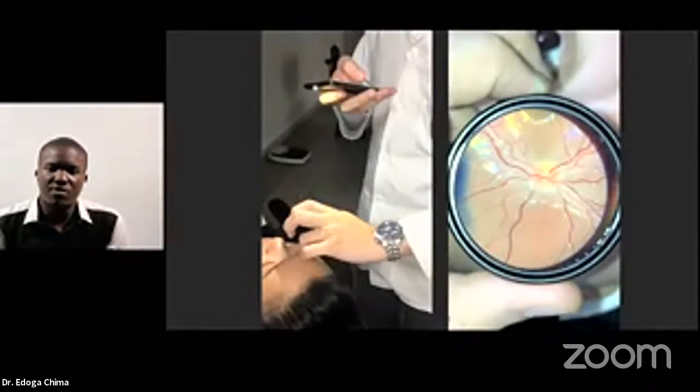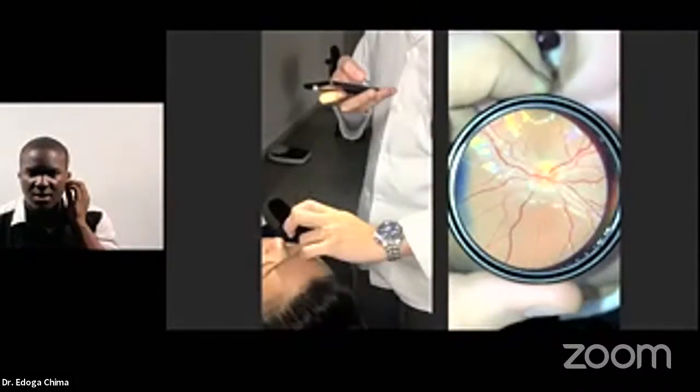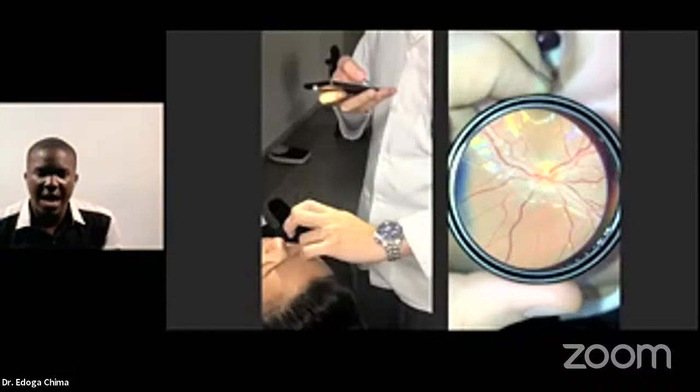If you want to move the lens forward, you must move the phone forward. If you want to move the lens back, you must move the phone back. And it's also almost impossible for you to coordinate these movements without having lesser movement of the lens from the eye vis-a-vis the movement of the phone with the lens. So in order to solve this, most people developed adapters. We have different kinds of adapters on the market.